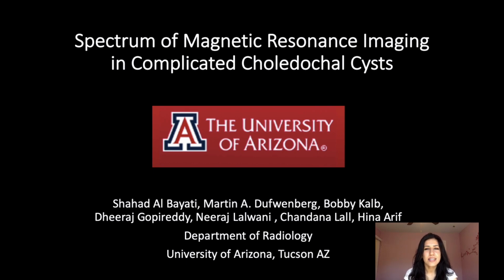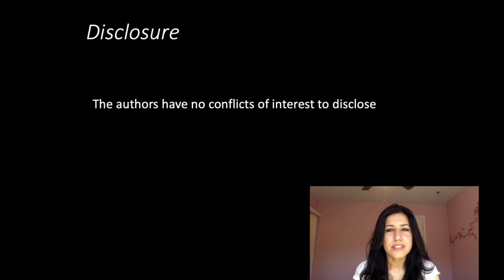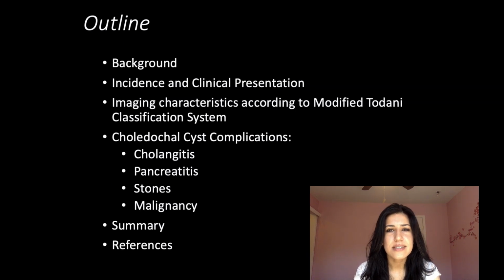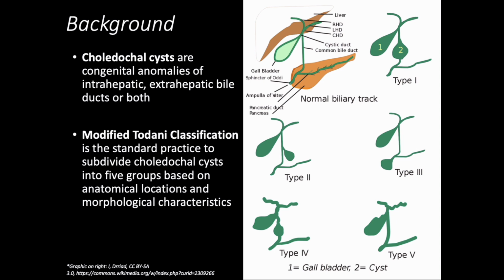I'm a radiology resident at University of Arizona in Tucson, and today I'm going to talk about the spectrum of MR imaging in complicated choledochal cysts. No conflicts of interest to disclose. So I'll talk about the MR imaging approach for the Todani classification of bile duct cysts and the different complications of choledochal cysts. We'll start with a quick background.